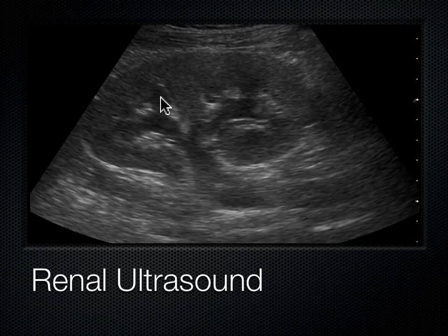And so then these pyramids, they all coalesce and drain into the renal pelvis, or sometimes you call this the sinus of the kidney. And here, this is why it's anechoic, because there's more fluid coming there, and then eventually they exit out the kidney and into the ureters. And the ureter comes down, one from each kidney, and they enter into the bladder, in the back of the bladder. And you don't see the ureters very well on ultrasound because the ureters are covered by bowel and fat and things like that. So they're really hard to see. They're very small usually, unless they're dilated, then you can see them. So once the ureter exits the kidney, we no longer see it.